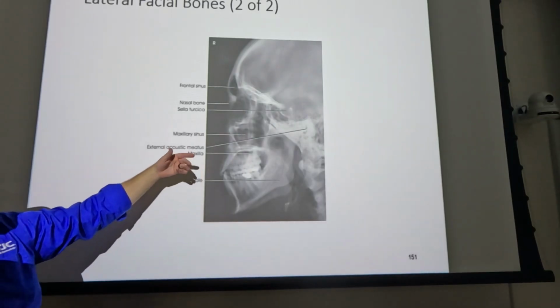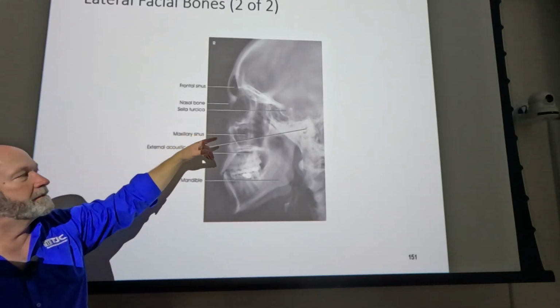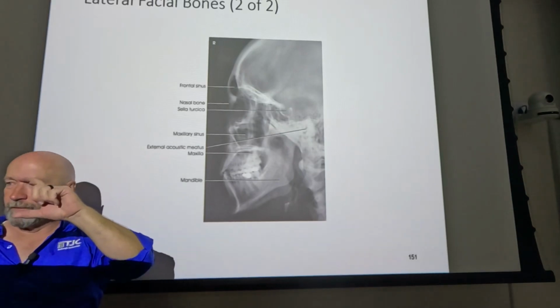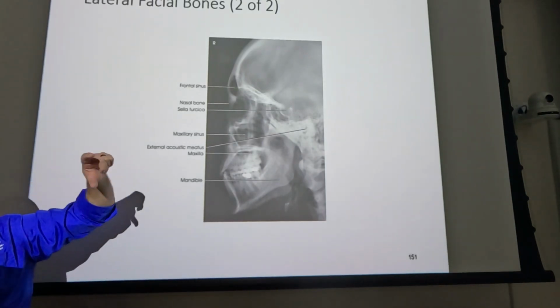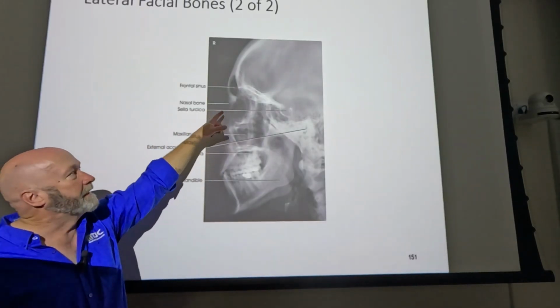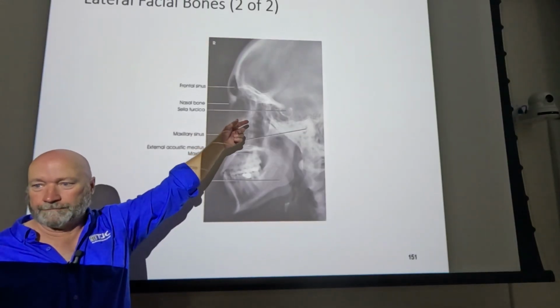So you shoot that, and let's say you can see the nasal bones well, right? So you reposition the patient and you collimate down. Your collimated field for nasal bones shouldn't be more than about 2.5 inches. They're short bones, little bitty bones, maybe 2.5 by 2.5, 3 by 3, something like that. But what are you still going to be blasting into if you collimate down to that?